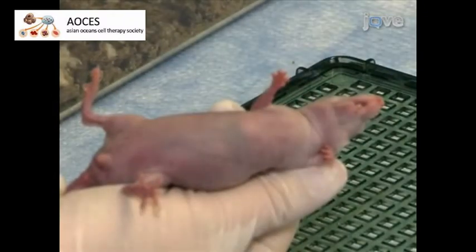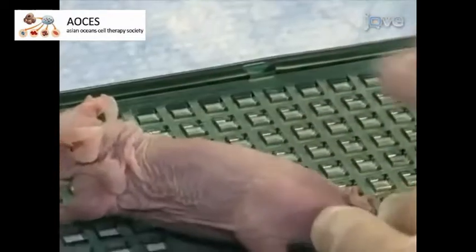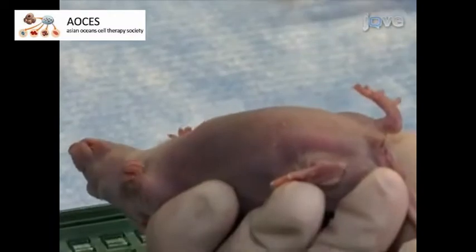Turn the mouse over so that the abdomen of the mouse is facing upwards. If the mouse can freely move its head, release the grip and try again so as to avoid being bitten during the injection. Hold the mouse slightly inverted to help move the organs away from the injection site.